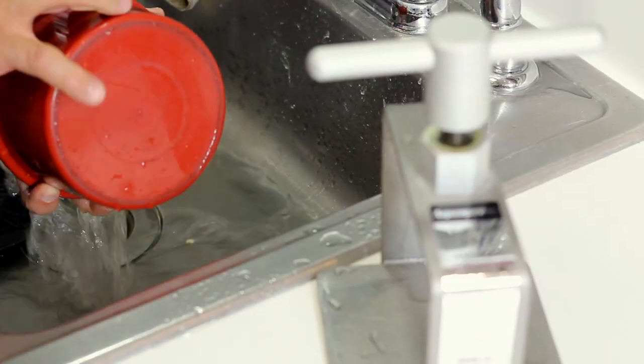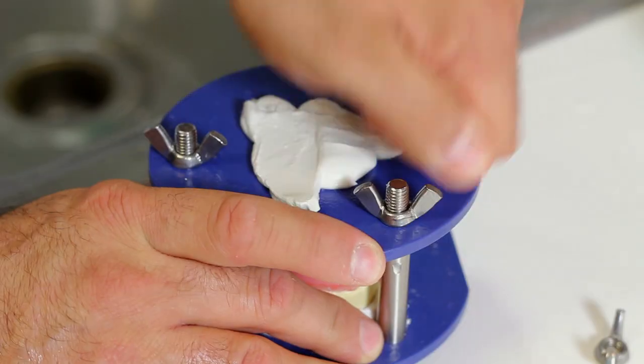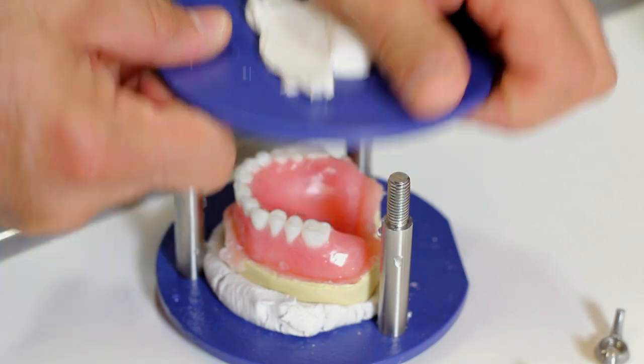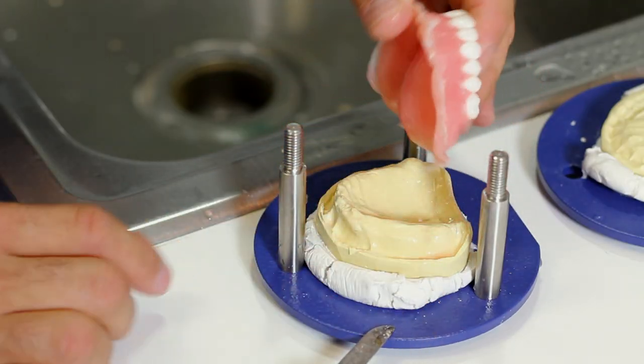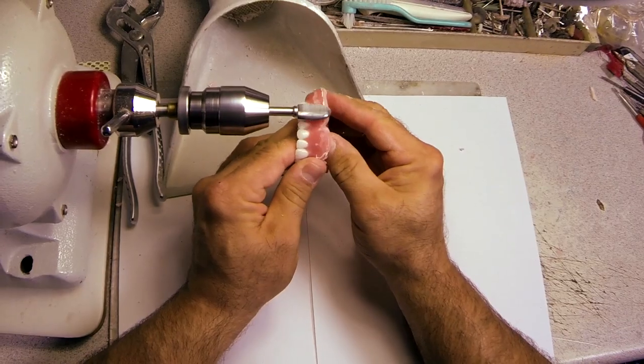Open the Aquapress, remove the jig, unfasten the wing nuts, and carefully remove the denture. Trim and polish as normal.